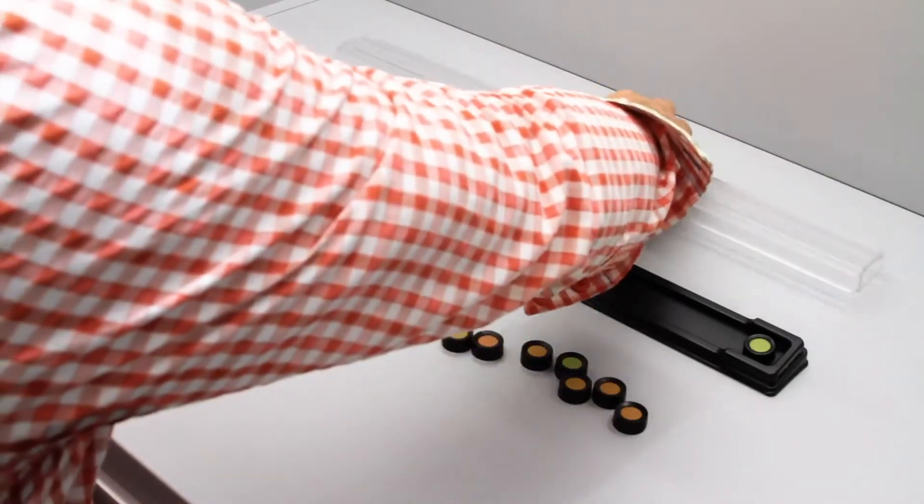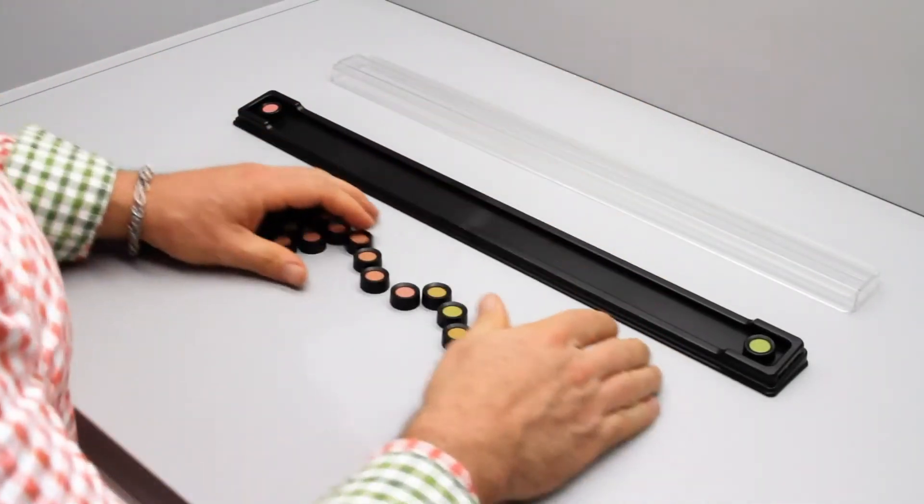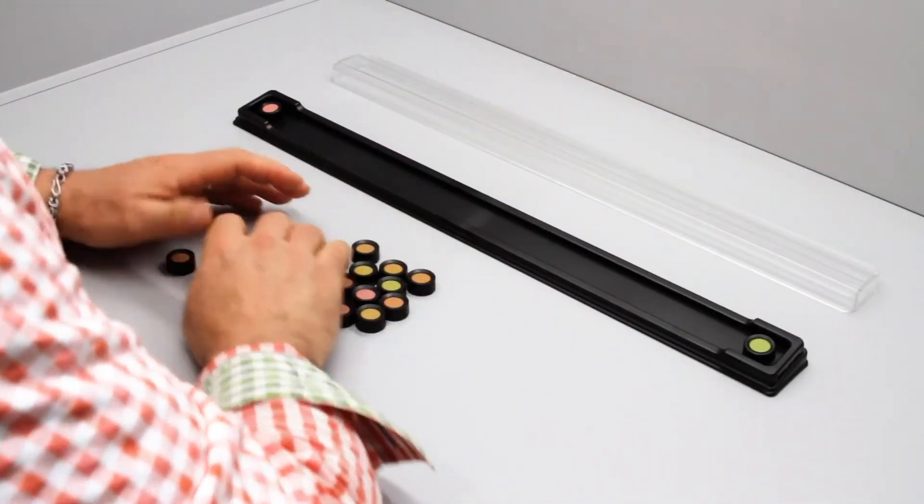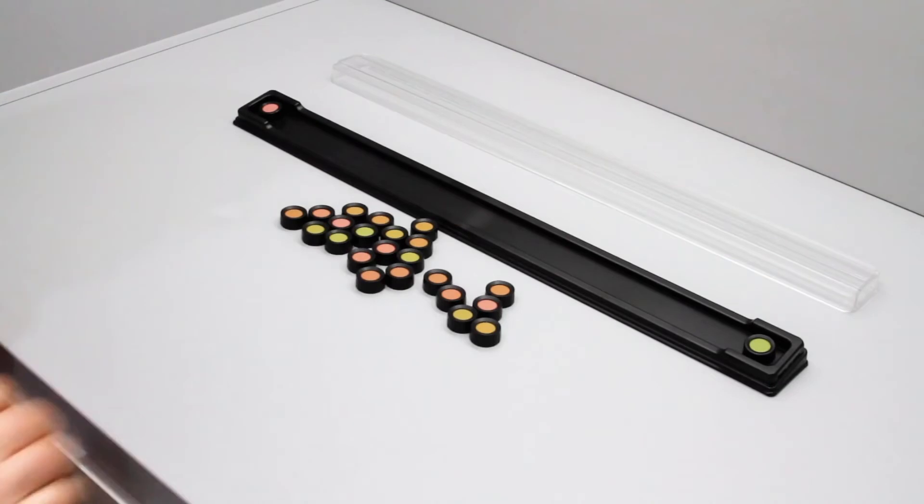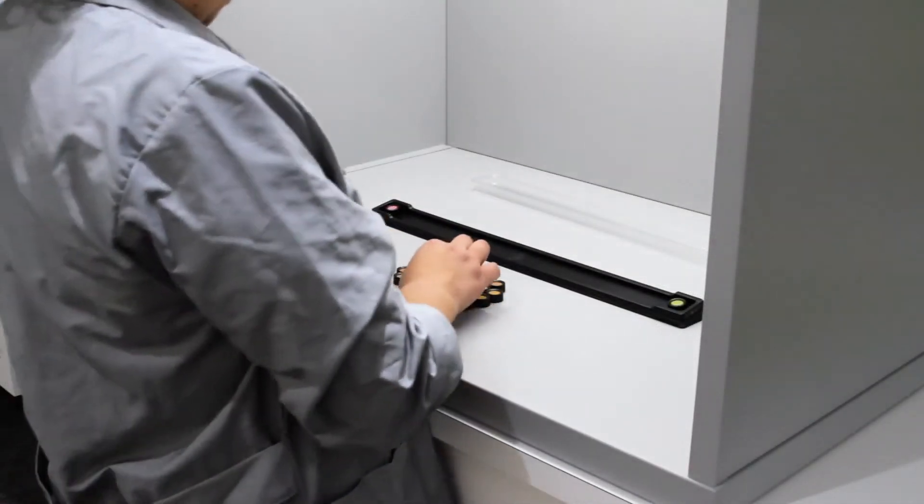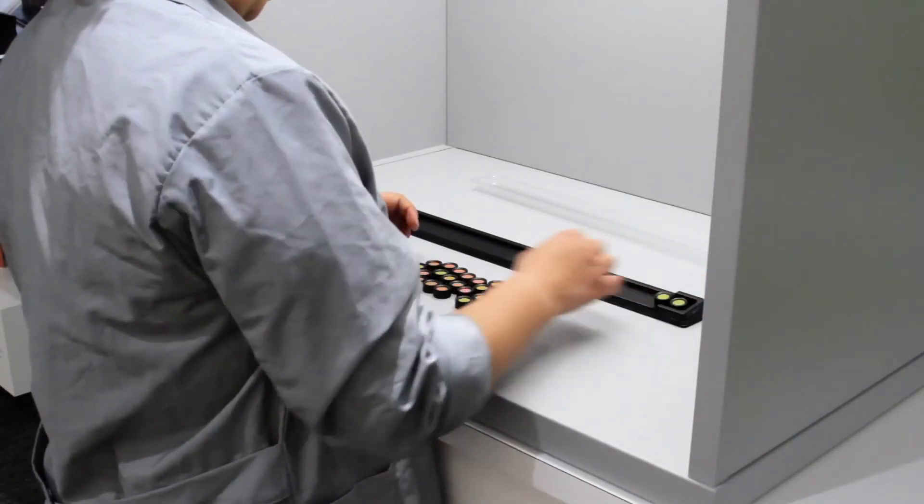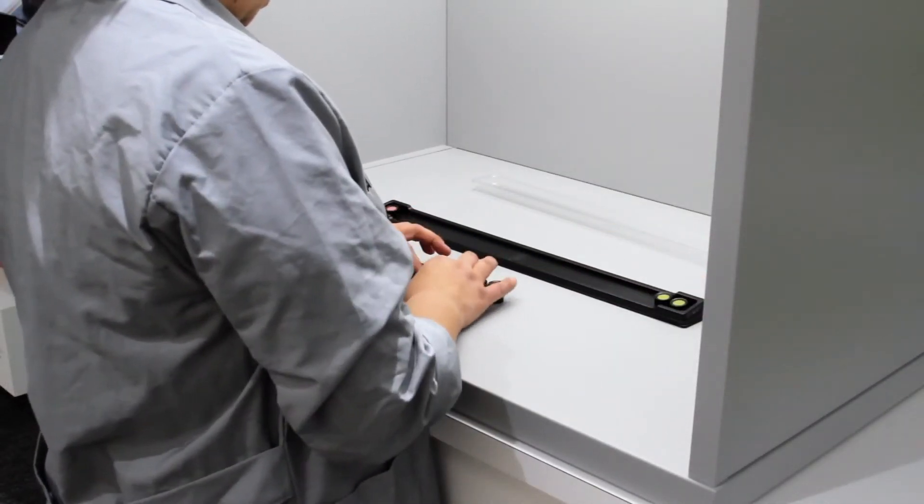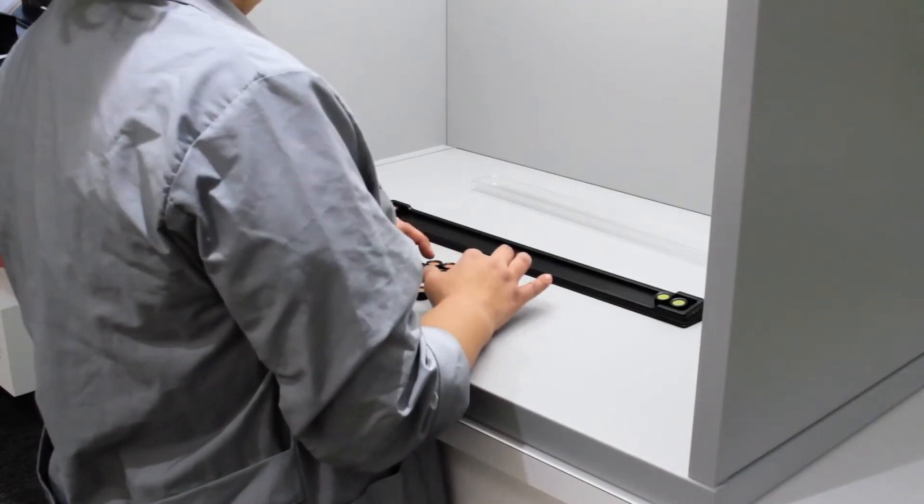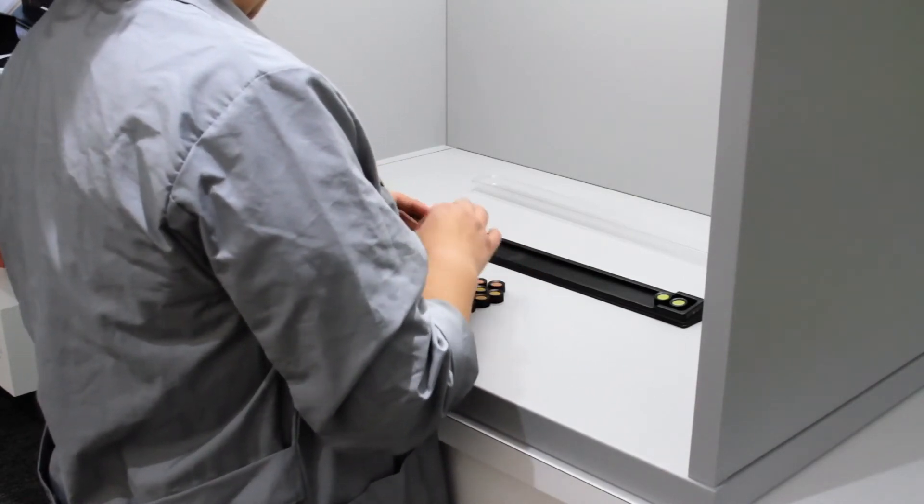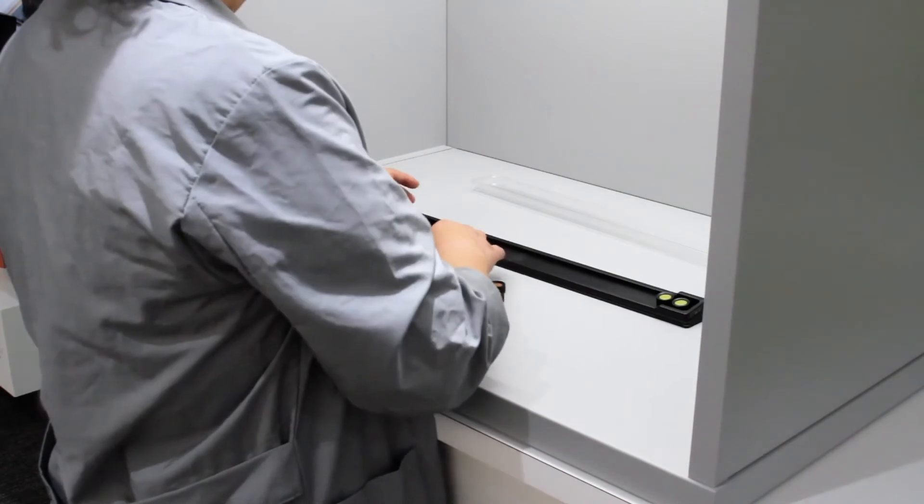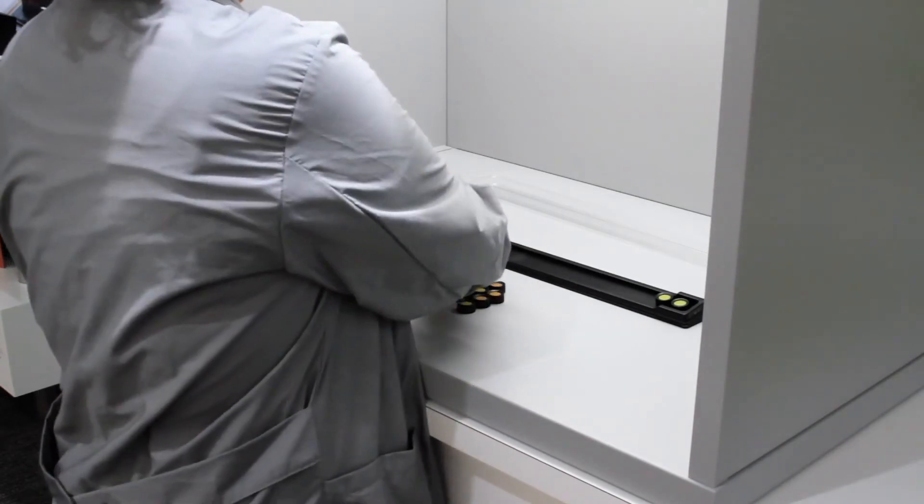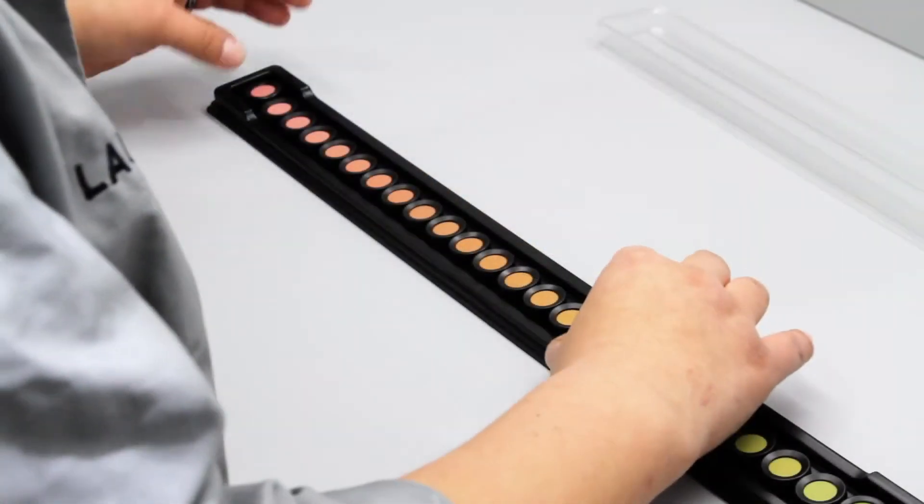To administer the test, open one tray of colors and arrange the caps in a random order. Instruct the subject taking the test to arrange the caps according to color between the two end caps. They should not take too much time. If their eyes get tired, direct them to look at a neutral gray surface such as the back of the light booth.